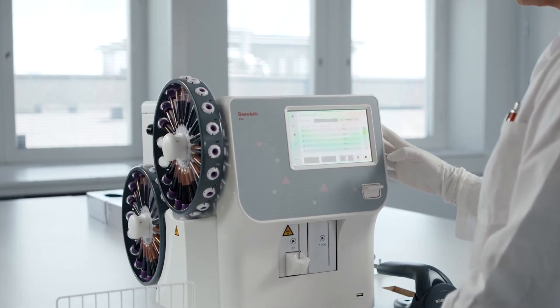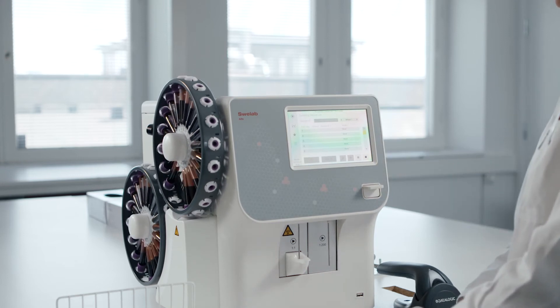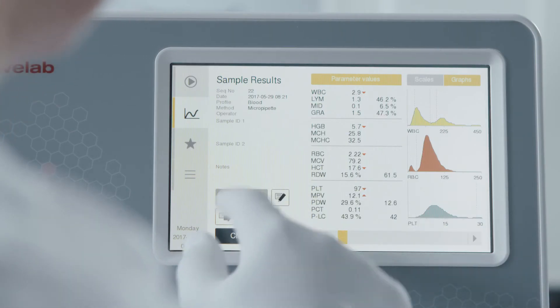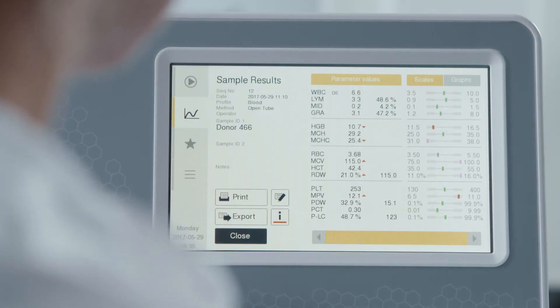Swelab Alfa Plus also lets you select how you view results — choose between histogram or reference scale views, for example. Printouts are also customizable and cover any or all of the parameters you choose to display.